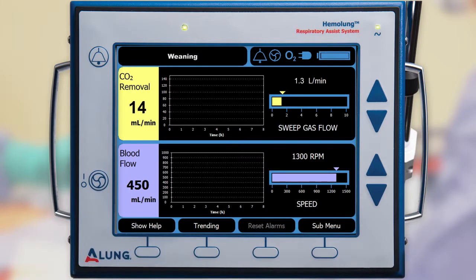The sweep gas flow rate can be reduced to zero while the blood flow is maintained to evaluate the patient's response to withdrawing therapy. This will disable the low CO2 removal alarm.